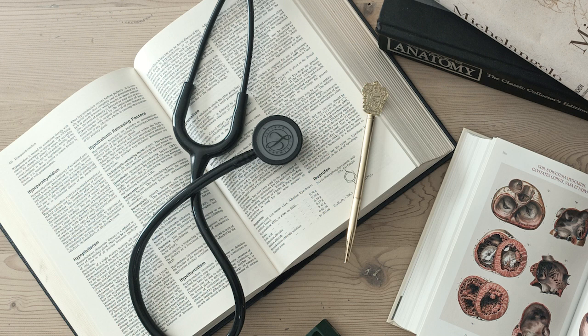Absolutely. And just remember that systematic approach to ECG analysis, starting with the P wave, assessing the PR interval, then examining the QRS complex, that really is your most powerful tool for diagnosis. Combine this with your understanding of the clinical presentation and pulse characteristics we discussed, and you're well on your way to mastering arrhythmias for your upcoming exams and, much more importantly, for the well-being of your future patients. Nail down that systematic approach.